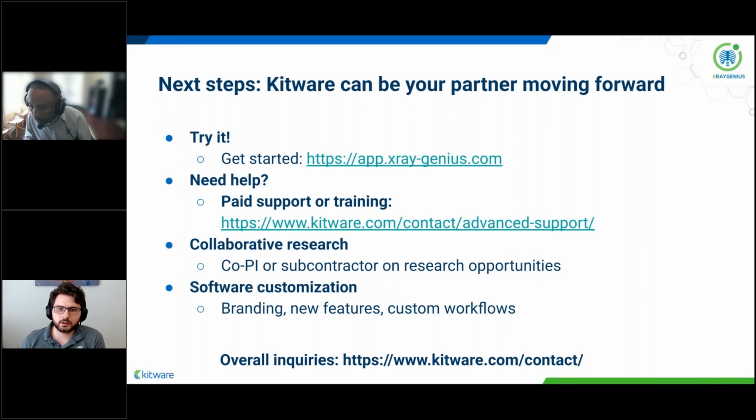There was a comment about a potential use case for this that I wanted to grab the screen share and do a quick demo. Okay, I'll stop sharing here. But can you repeat the question for others?